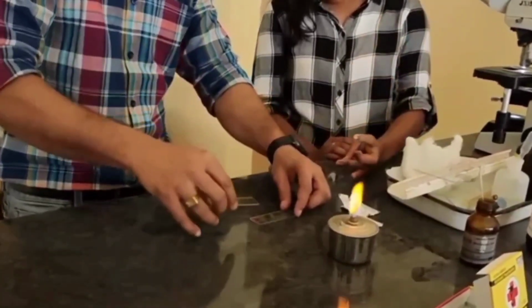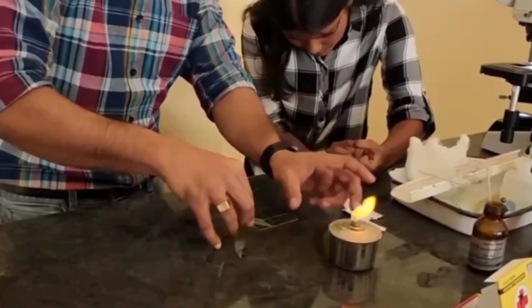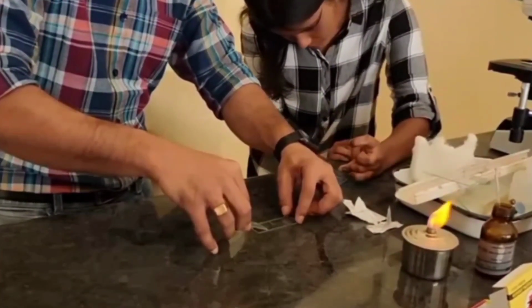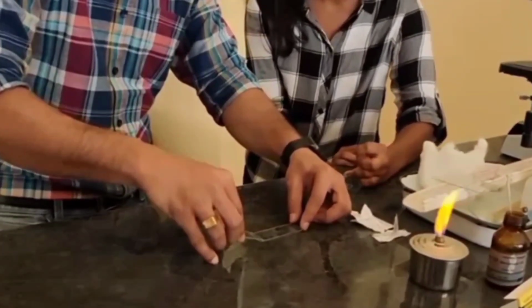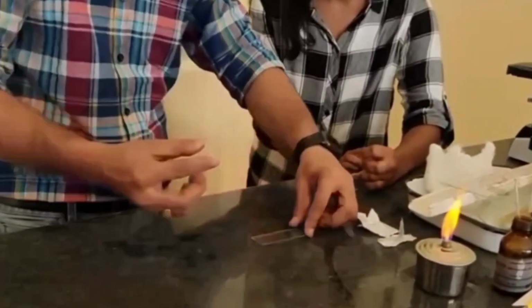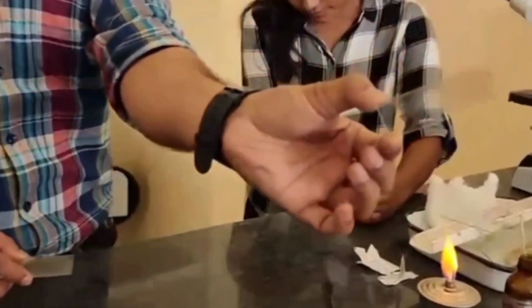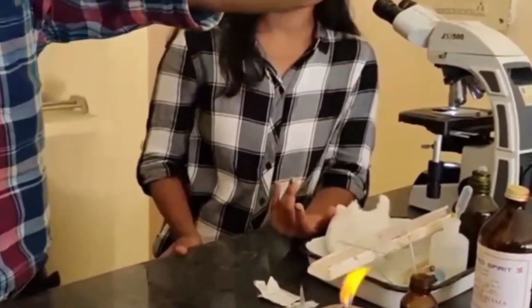Then, with another slide, I will show you how to prepare the blood film with the collected blood sample. So a 45-degree angle is there and I am allowing the blood to spread. So this is the way we can make the blood film. I will repeat this procedure again so it will be clear for you.